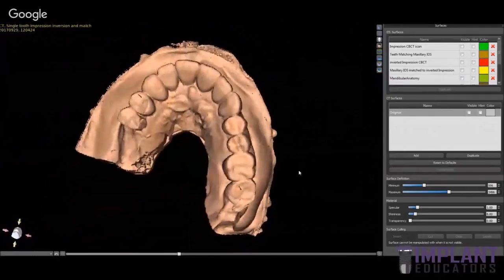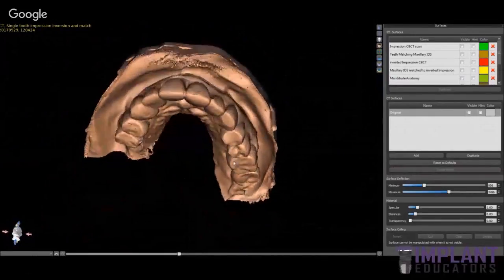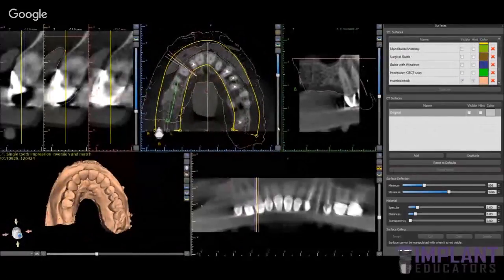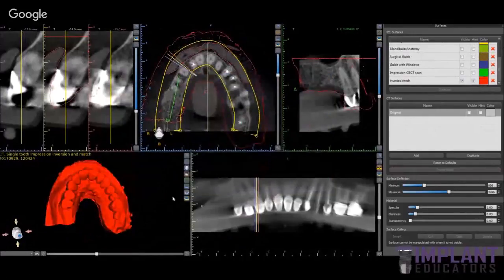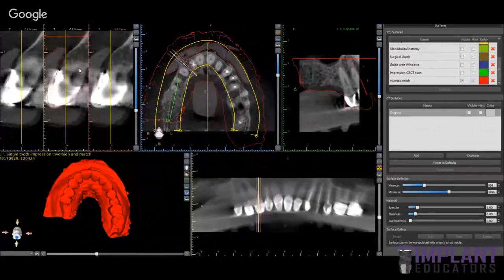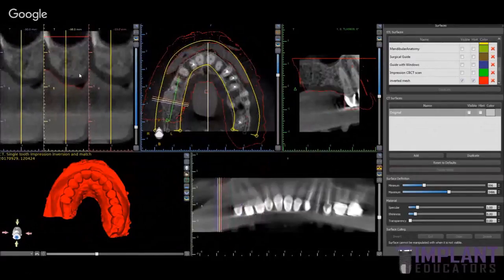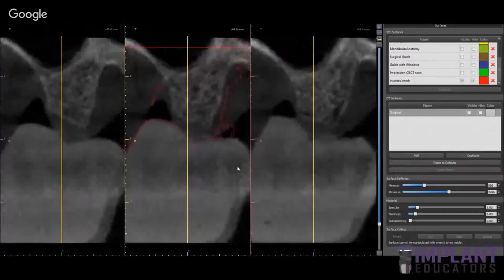You can see there on the right premolar, there was a pull in the impression material. It's a positive, so it's not going to affect us making a guide with this impression, so it's fine. And what we're doing here is changing the color so that it shows up a little bit more clearly. And obviously, it's going to be matched up perfectly because the impression was. It's just an inversion of the impression, or what we call a digital pour, basically.